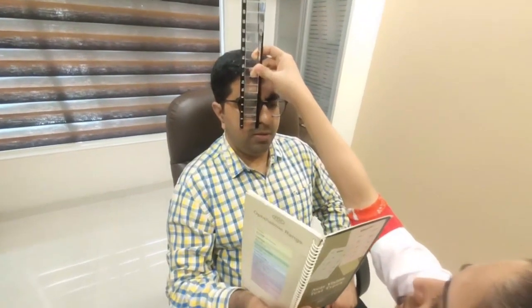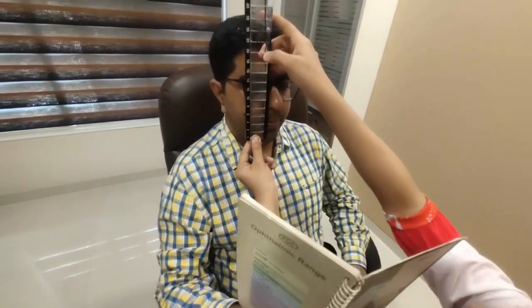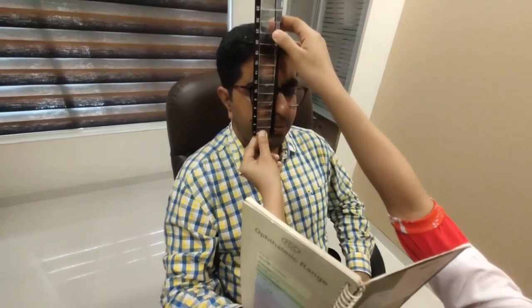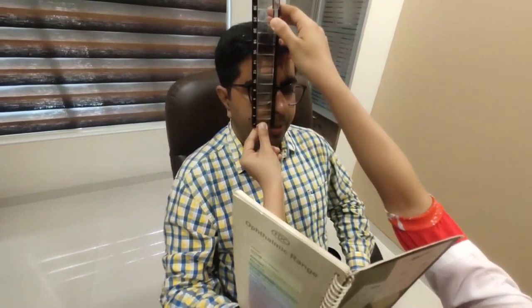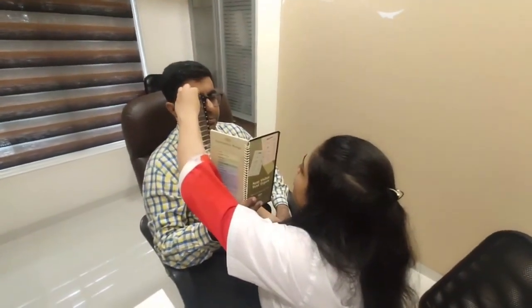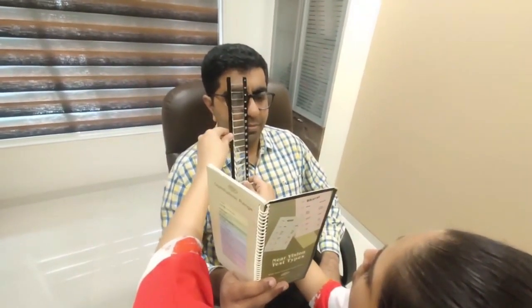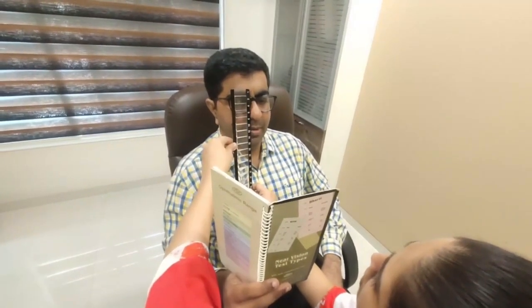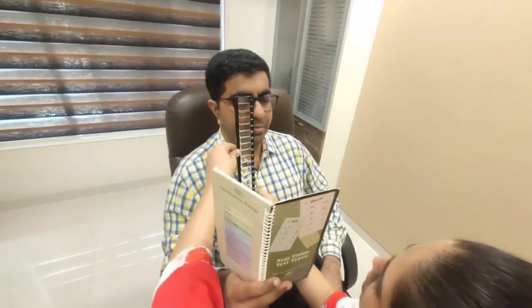Single, clear, blur. Now double, yeah. One, a little blur, clear. Yes. Single, clear. No, already blur, but double. Now blur, double, single, double. Now double and blur. Double, but not blur.